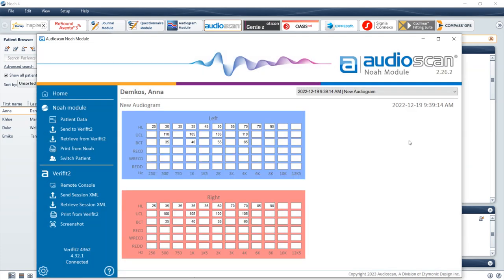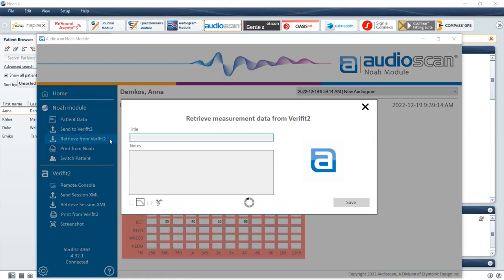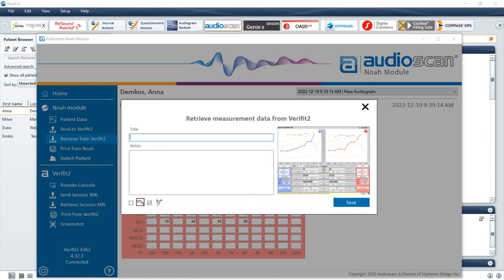Once you have measured tests you would like to store in the AudioScan NOAA module, select the Retrieve from Verifit 2 button to pull the data from the AudioScan product, along with an image of the current screen. A preview window will display with fields for entering an individualized title for the data file and/or adding notes that will be saved into the module.